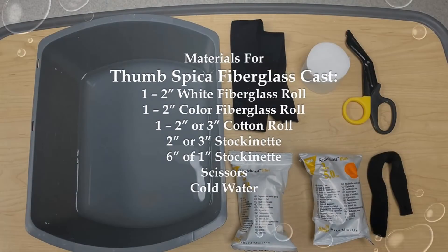Before you begin casting, gather the material that you will need. The amount of material may vary for each patient due to size and age. The materials for a Thumb Spica cast are: 1-2 inch white fiberglass roll, 1-2 inch color fiberglass roll, 1-2 or 3 inch cotton roll, 2 inch or 3 inch stockinette, 6 inches of 1 inch stockinette, scissors, and cold water.